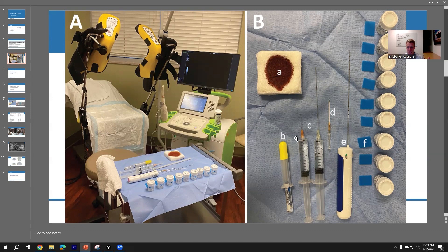This is the kind of back table setup that I use. I use a betadine prep, some rectal lidocaine, two syringes. This is a 25 gauge inch and a half needle. This is a six inch 20 gauge needle. And then this is a 14 gauge angiocath. This is a biopsy needle — I just happened to have the Argon one here, but you can use the barbed one. This is the standard side-cut one, and this is a coring one. These little blue sponges are nice. And we've been individually bucketing our specimens, putting them each in their own container.